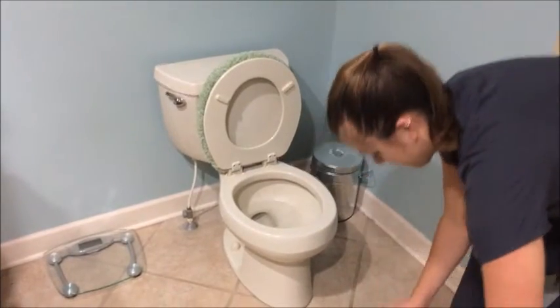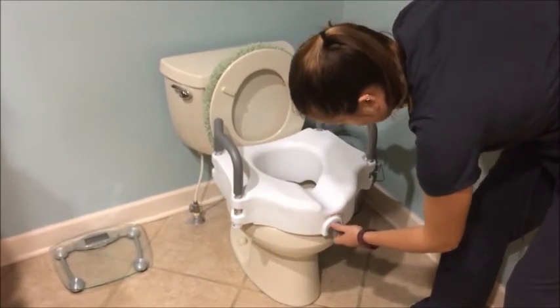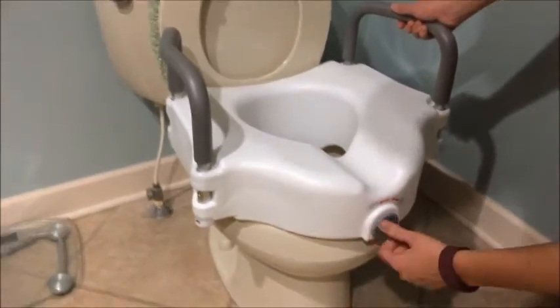Next, place the raised toilet seat onto the rim of the toilet. Direct the seat downwards so the lip on the back of the seat catches the rim of the toilet. Finally, turn the knob on the front of the seat to lock the seat in place.